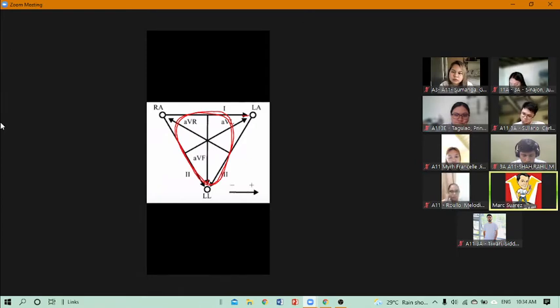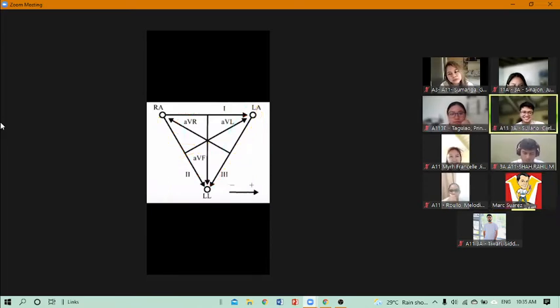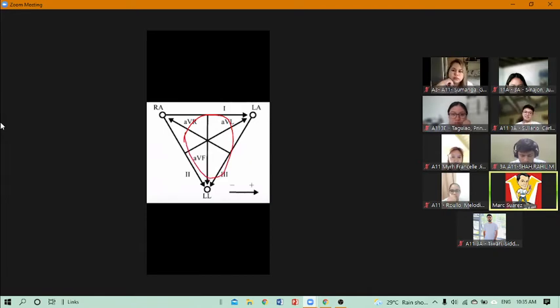We are missing the precordial leads. So I am drawing here a representation of the thorax. Does everyone follow? The heart is too large. I'm sorry. Again, let's do this again. So this is the heart. Again, I'm sorry. Okay, this is much better.